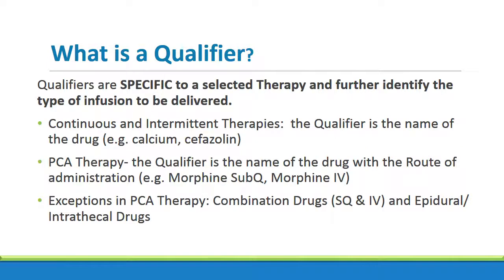In a hospital setting, the qualifiers are typically set according to area of usage, an example being the ICU or oncology department, or by population, such as TPN patients or pediatric patients. This narrows the search criteria when looking for a drug. Because there are various conditions and treatments offered in a single setting, the community, it is difficult to set the qualifiers based on area or population. For this reason, in our library, the qualifiers are in fact the name of the drug.